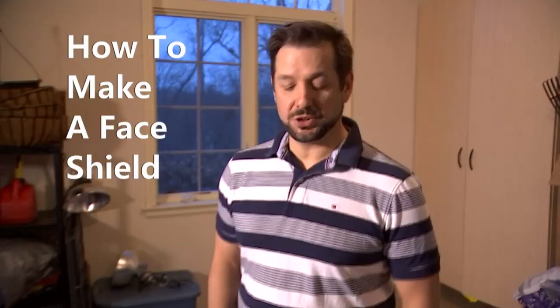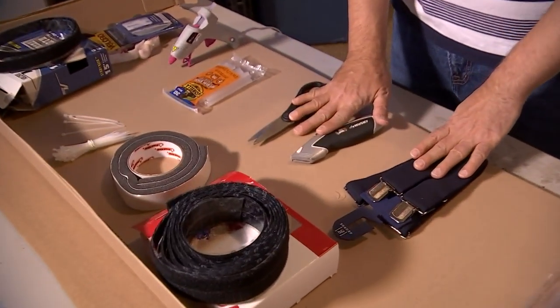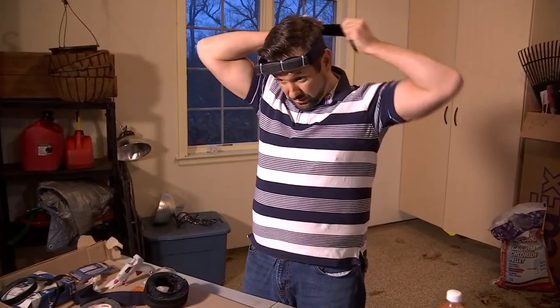To manufacture these face shields, there are two steps. The first step is the bottle, which makes the actual face shield. The second step is making the headband that the shield is going to get Velcroed onto.